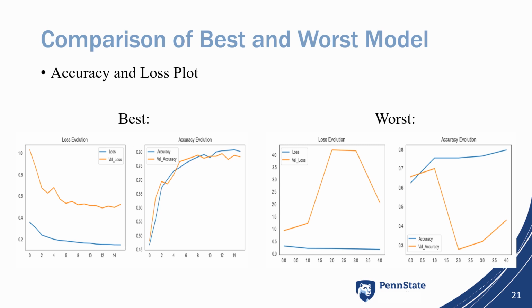And the worst model went through only 4 epochs. That explains why the model performed poorly. It didn't get to have adequate training time, and we can see that there's a major accuracy drop from the second epoch. The third and fourth epochs couldn't reach the previous best accuracy. That's why the early stopping cut the training process prematurely. We can see that the accuracy lines don't align with each other, meaning that the biases are not enough to influence the validation data.